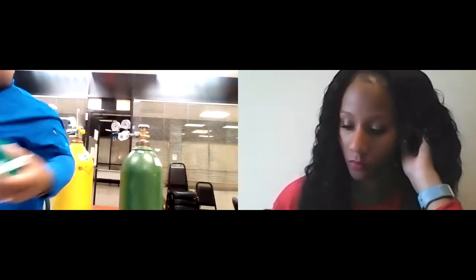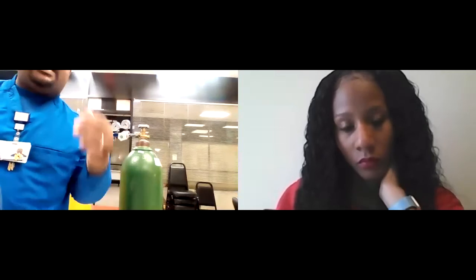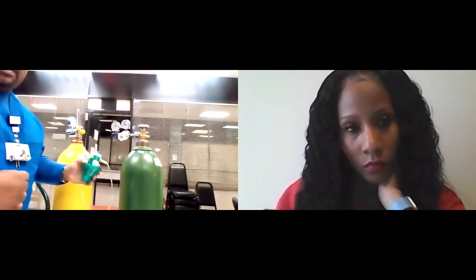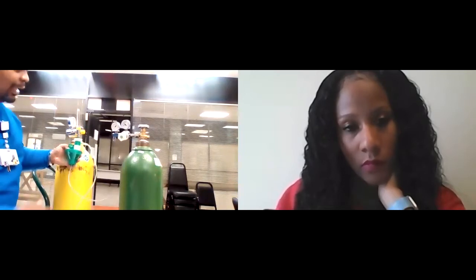All right. So the first flow is my source flow, which is gonna be my oxygen. Now, I can make a determination. This doesn't necessarily have to go on the oxygen side. It can go on the air side, but you'll learn that later. It matters how much FiO2 they need. If I know they need a lot of FiO2, then I'm gonna put it on here and bleed in air, right? But if they just need a lot of flow and not necessarily a lot of FiO2, then I can hook this up to the air side and bleed in the oxygen, right?